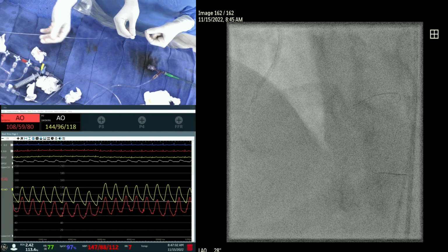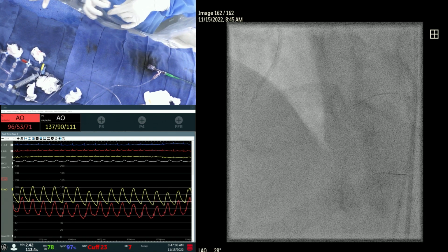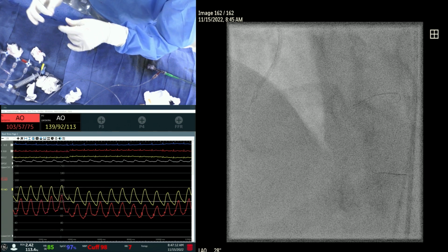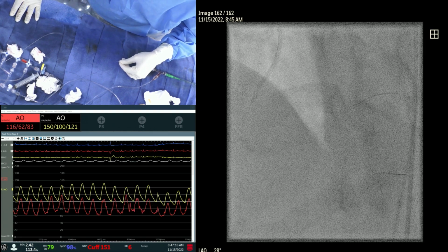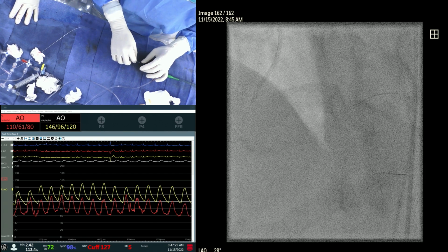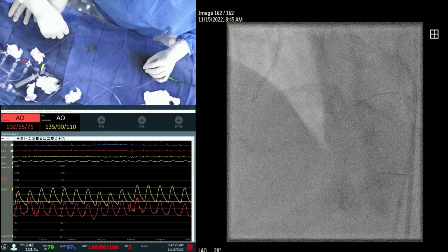Connect and go negative on this one. So we are going with a 2.0 balloon we had. We'll do a 2.0. Why don't you want to do provisional? Provisional in what way? Into the PDA and just balloon the AV. Okay, that's fine. Don't connect, please, like that. No, but you have to go negative. This is a used balloon. Go with the used balloon. How to do it: use the syringe. Good. Done. Okay, go. Do nothing now. We've gone negative. Yes.